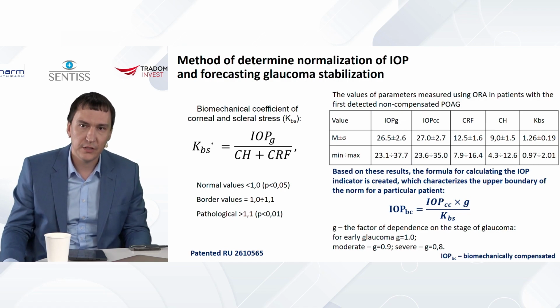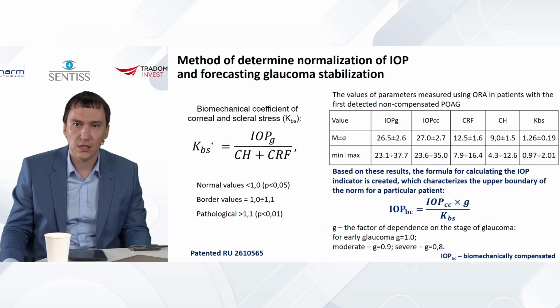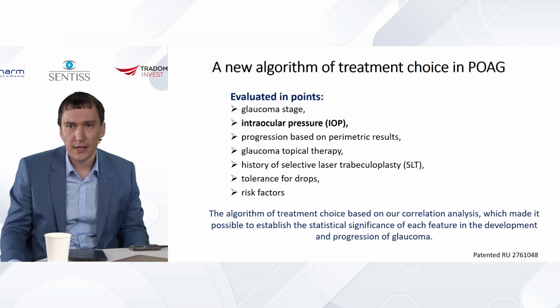And then the training of AI by the results of biplanar applanation, not only in the context of pressure, but also in the complex of all the results, could later on give us quite reliable prognosis of glaucoma progression.